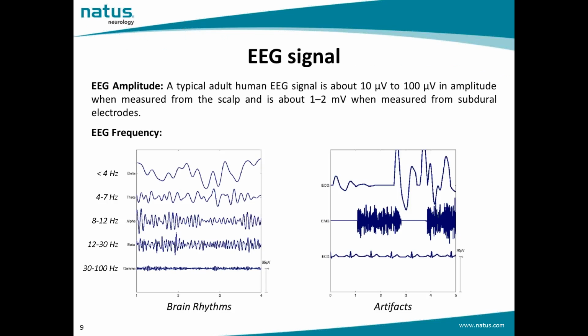As you know, electroencephalography is one of the key tools for observing brain activity, and it's the key to diagnosis of many neurological disorders. EEG is widely used in many areas of clinical work and research. It's a readily available test that provides evidence of how the brain functions over time.